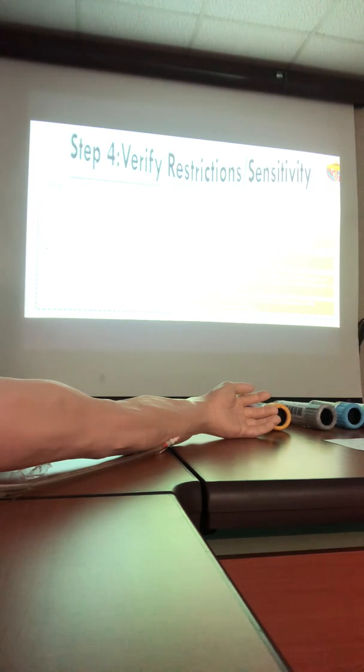Should the patient fast from water too, or drink water during the fasting? For food and any drinks, the patient should fast, but the patient should drink water during the fasting hours to prevent dehydration. Also for the glucose and blood group, the patient can drink water. All of them. Because if the patient doesn't get water, they will be dehydrated and it will affect the results.